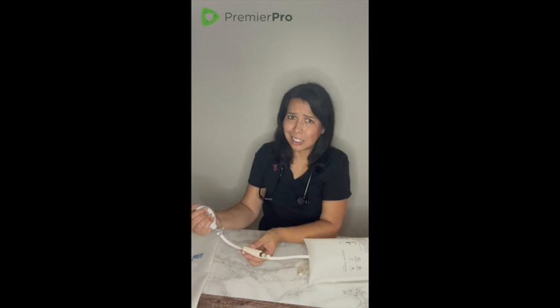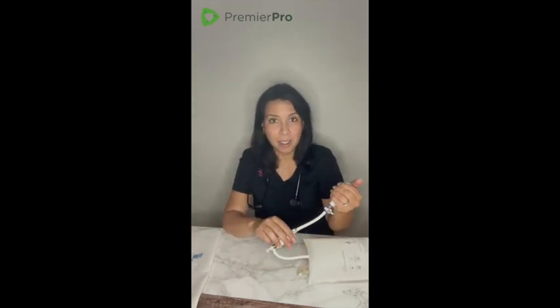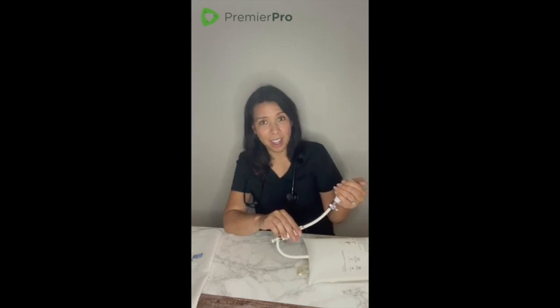Now it's starting to get a little tougher. We're really at a high pressure here. Did you hear it? The valve is engaging, and it's not going to let me get too far into the red zone. It's going to start to push me back into the green zone.